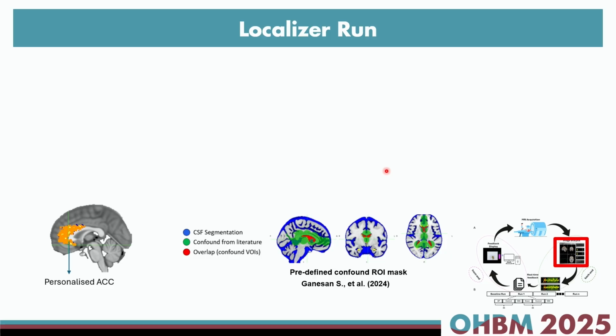And I want to use this as noise. So at some stage, not in TurboBrain Voyager, but in my MATLAB script, and right before showing to participant, I want to regress out this data from this confound region, just to make sure whatever I'm presenting to participant is the pure activity of that target region, not any noise.